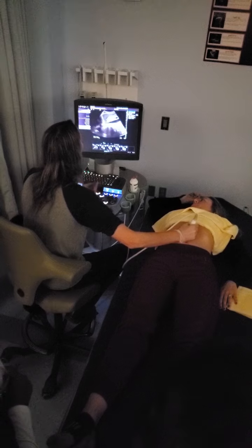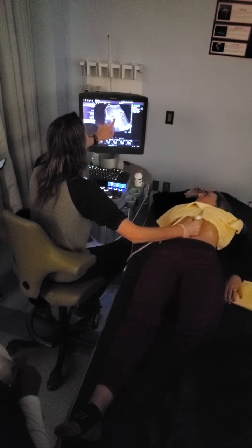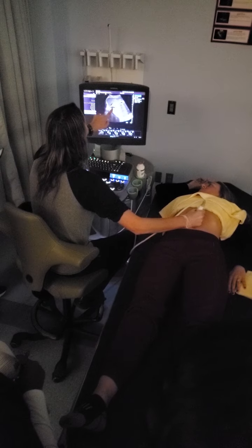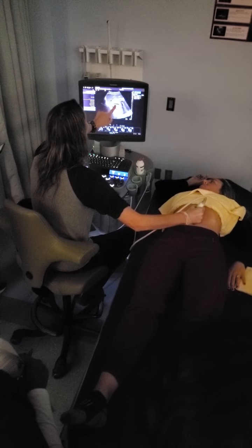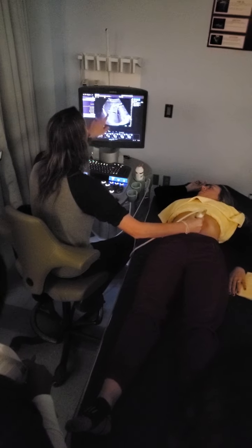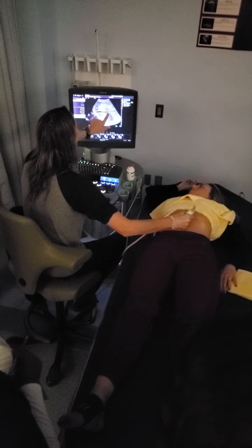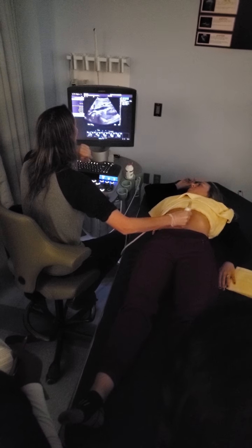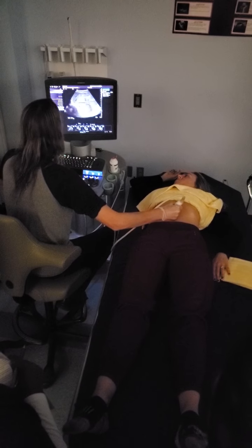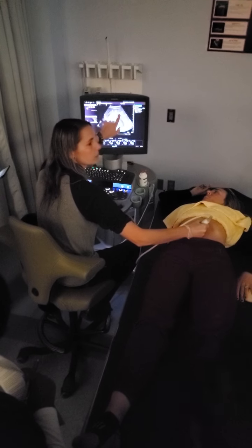So we did IVC just slightly to the right of IVC. So there's our medial. And you can actually see this hepatic cruising. The more inferior this hepatic gets, the more laterally we are. So here we are, IVC. This is going to be our medial, mid-medial, mid-lateral, lateral. And you'll notice too that when we see the hepatics in length, we're going to see the portal veins in cross section. So IVC is back here. We're going to follow this hepatic. Which hepatic will this be? Right. Yes, you're correct. And so when we see these hepatics in length, we're going to see these portals in transverse. They're going in opposition.